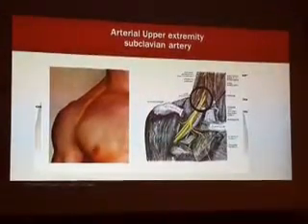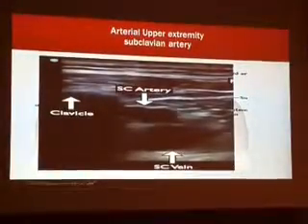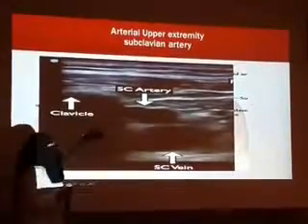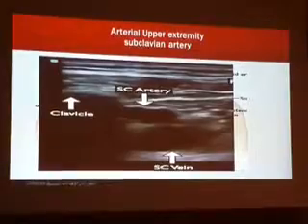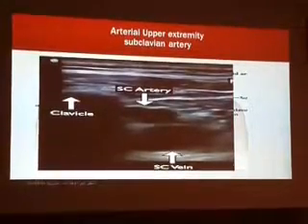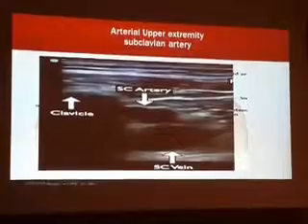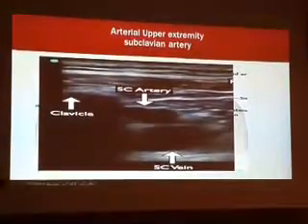Again, this is the subclavian. The clavicle is your landmark, and this is how it looks by ultrasound. So the bone comes with what? With the black shadow. This is the clavicle. These are the artery and vein, the subclavian artery and vein. And you should know how to differentiate between the vein and the artery. How do you differentiate? The artery pulsates. Compressibility: here in the subclavian it's hard to compress. Pulsation is the first differentiator. Don't go away and think too much. Is it pulsating or not? So that is it for the subclavian.